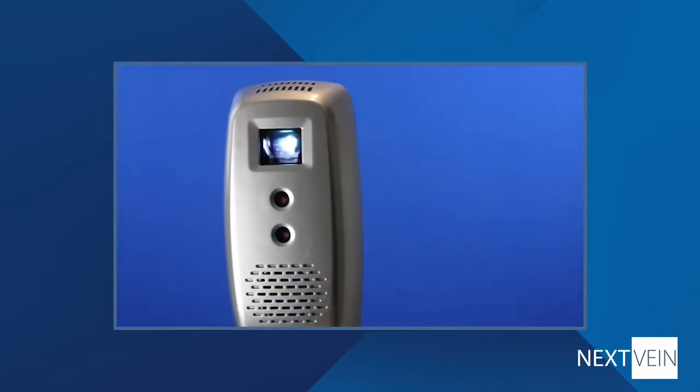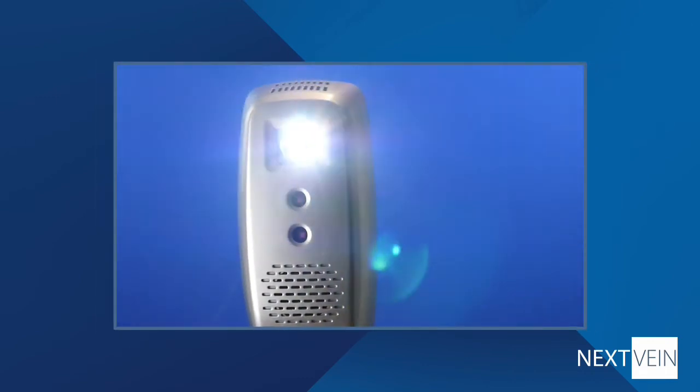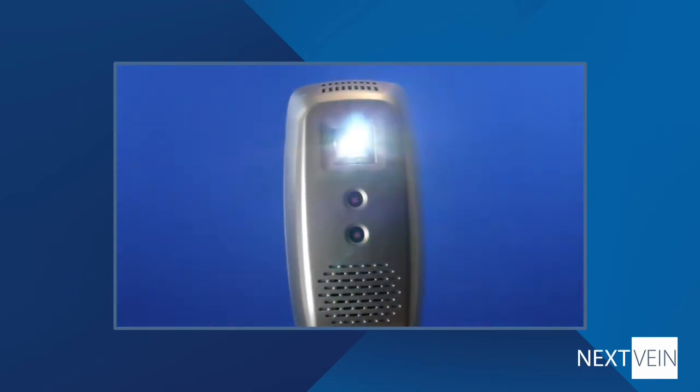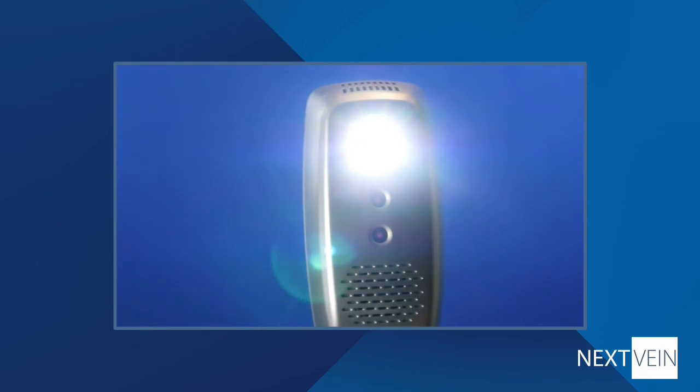While the LED light of the projection is safe, it's always a good idea for patient comfort to avoid shining the light into their eyes. Like any bright light, it may cause discomfort.